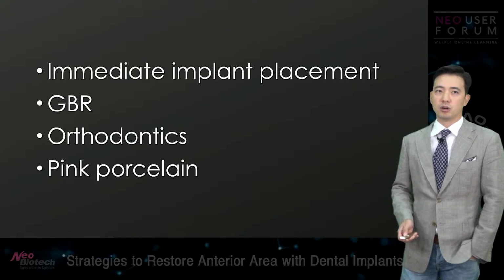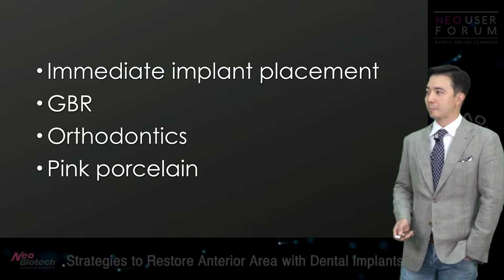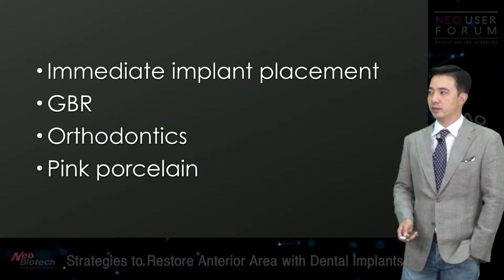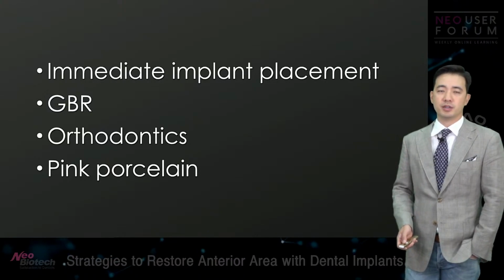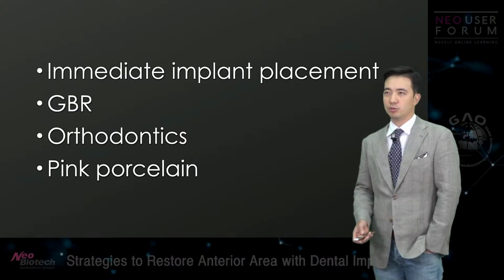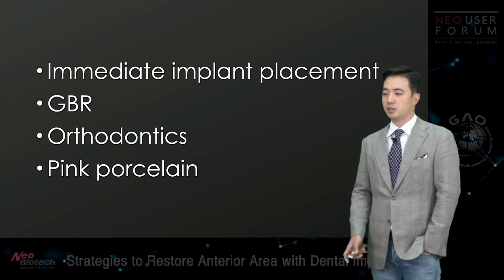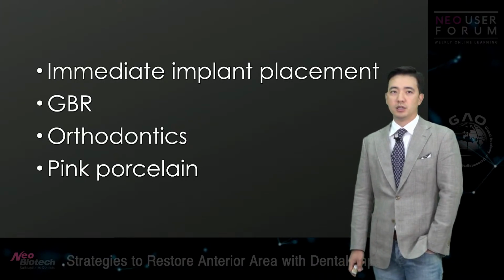We're going to talk about some of the cases along the presentation. And of course, pink porcelain is another option, because you just cannot restore papilla under certain circumstances.